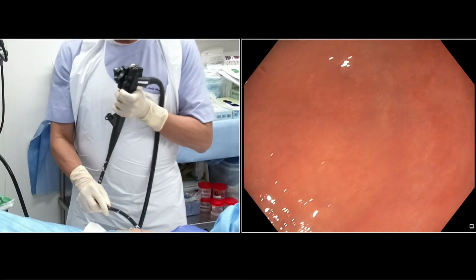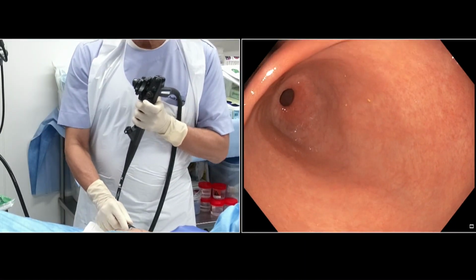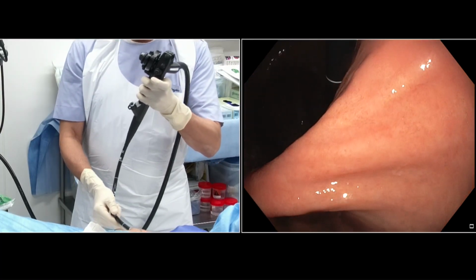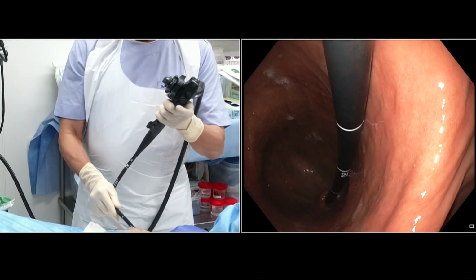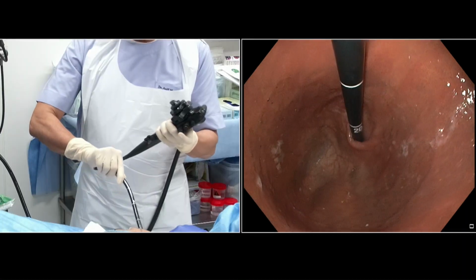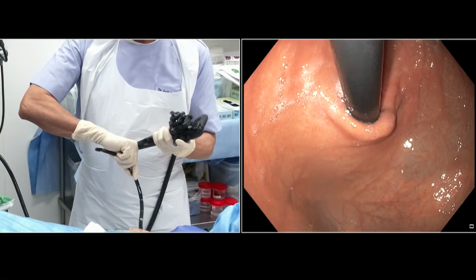Now the next thing to do, after you have fallen back in the stomach, is again go ahead, remain over here, and at this level, turn the big wheel completely up with your left thumb. So with this now you have taken a U-turn. Now after taking the U-turn, I am turning the shaft of the scope and pulling the scope back. So in a U shape, now the scope is seeing the fundus.